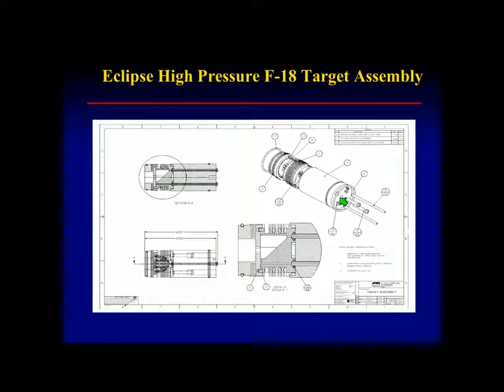This is just a picture of our schematic of our target. This is our F-18 target. And what you're seeing is actually the end that would be bombarded, and this is essentially screwed into the machine at the bottom. So let's move forward here.